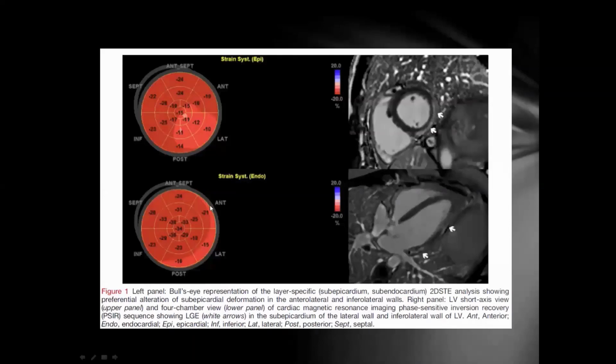There's a number of programs that do this. I don't need to mention them. I've used them. But again, this is an expert operator, expert investigator site type of technology. But again, what we're going to talk about at the end is in a great world where you can collect just a few images, are we able to get the images that your experts could use retrospectively on these large cohorts and learn a lot from that that will save lives down the road? So that's kind of where we're leading with this.